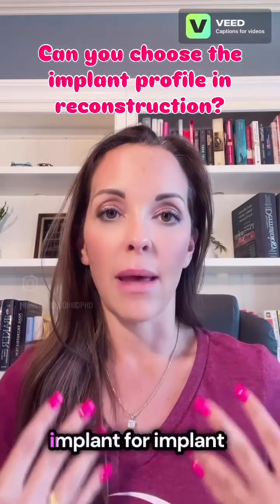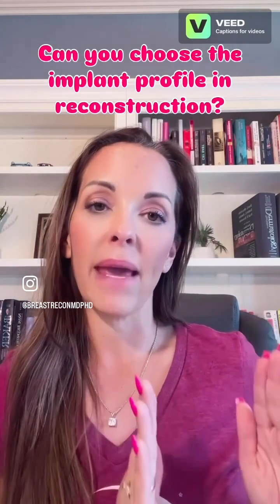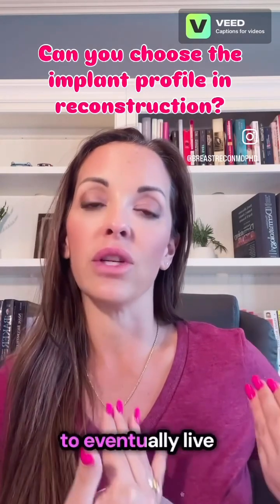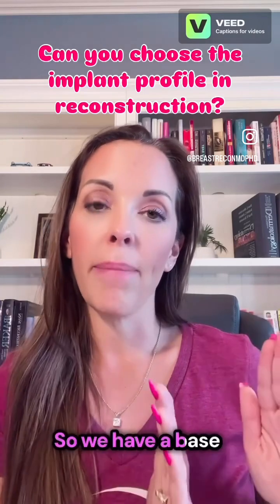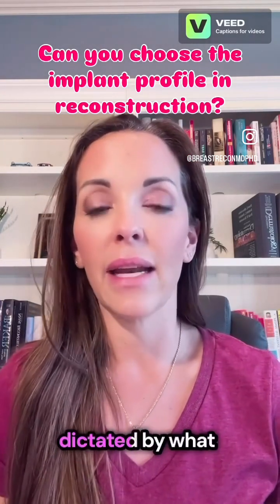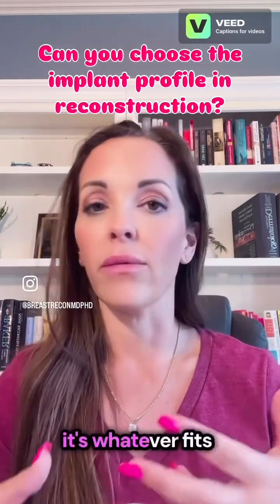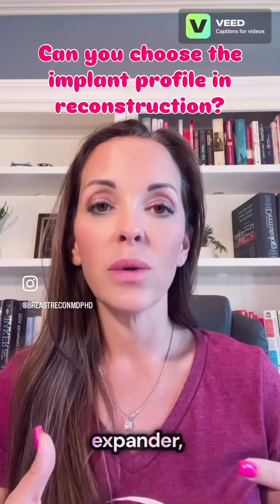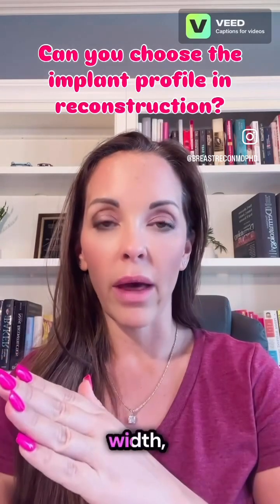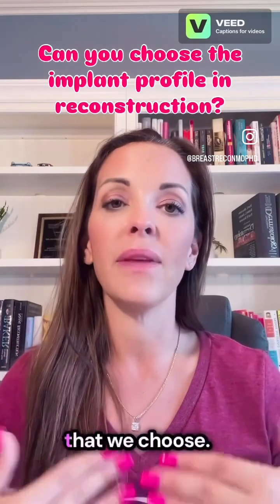When we choose an implant for implant-based breast reconstruction, we have to fit the base width of the patient. So this is the width of your breast, where we want the implant to eventually live on your body. So we have a base width. The volume or the size of the implant is just going to be dictated by what fits under the skin envelope. So if you have a direct-to-implant, it's whatever fits at the time of the mastectomy. If you have a tissue expander, it's whatever fits once the tissue expander is removed. So we have base width, we have volume, and that gives us a projection. It's not something that we choose.